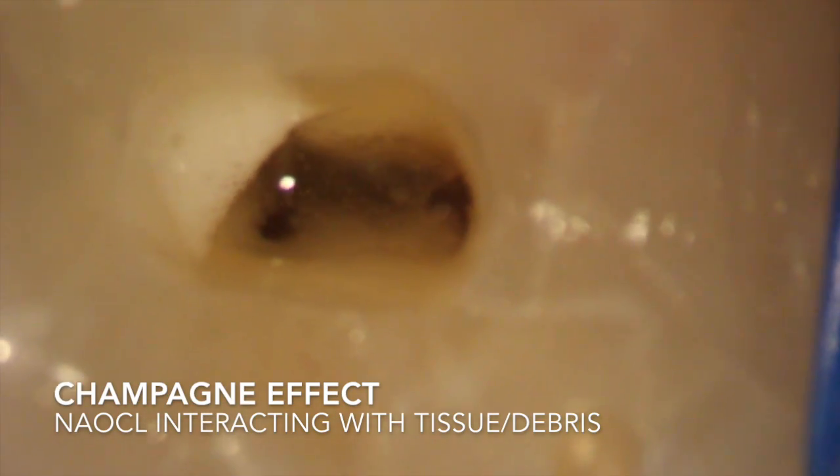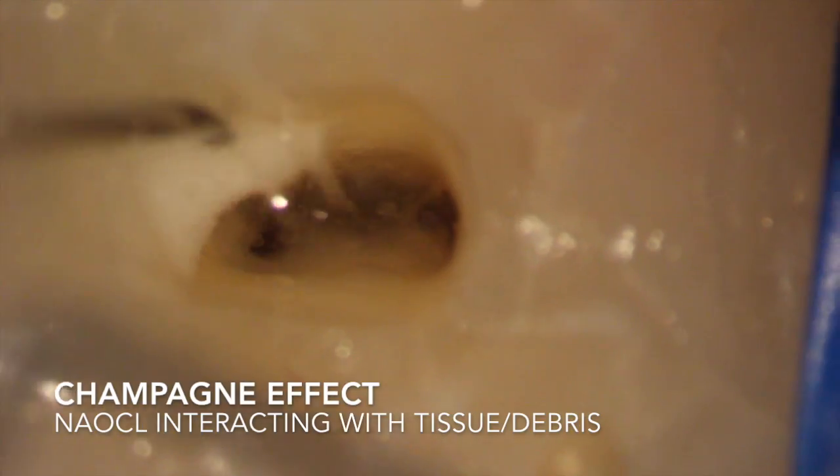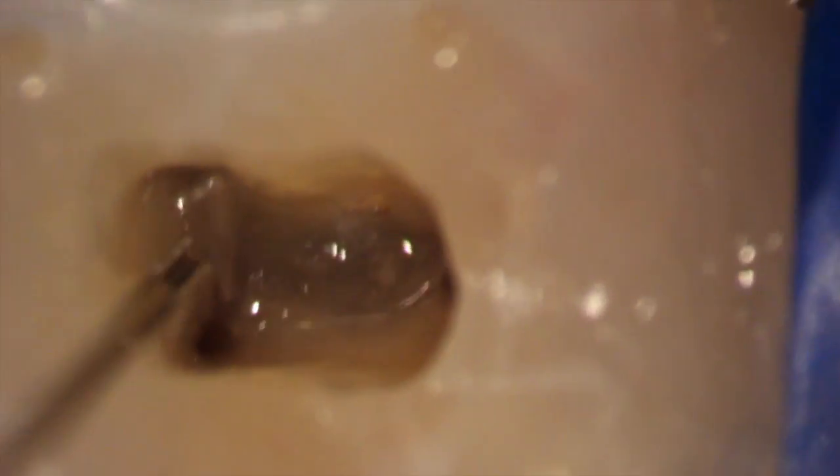During cleaning and shaping, you see a champagne effect with hypochlorite reacting with tissue and debris — I love seeing those little bubbles — and the bleeding has completely stopped. We did a very light flaring, very little, because we don't really want to flare these teeth out at all. The dentin is really thin, especially in the furcal parts towards the furcal walls of the canals.